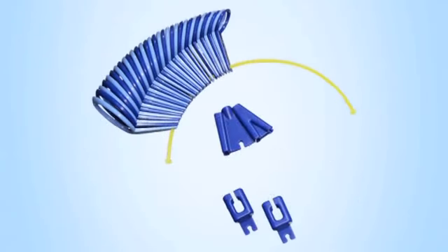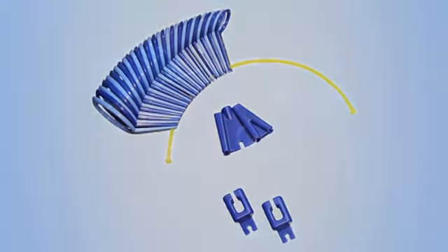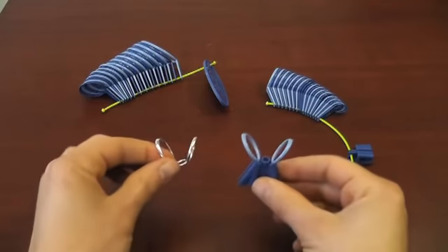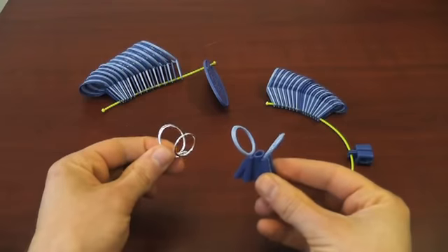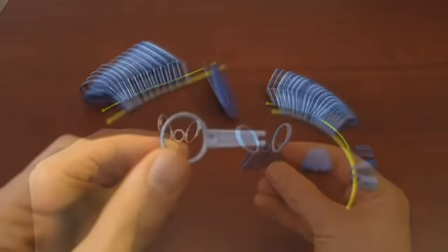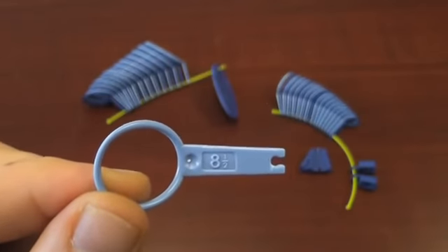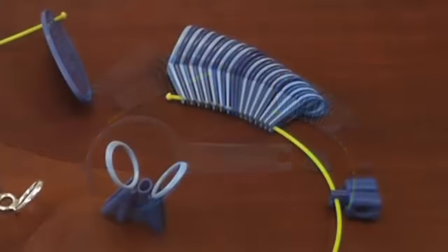To measure for a boutonniere splint, we will be using the easy-sizer tool. The easy-sizer tool has rings that have been designed to match the exact size and shape of our rings. Numbers referencing the size are located on the tabs, and alternating ring colors indicate whole and half sizes.